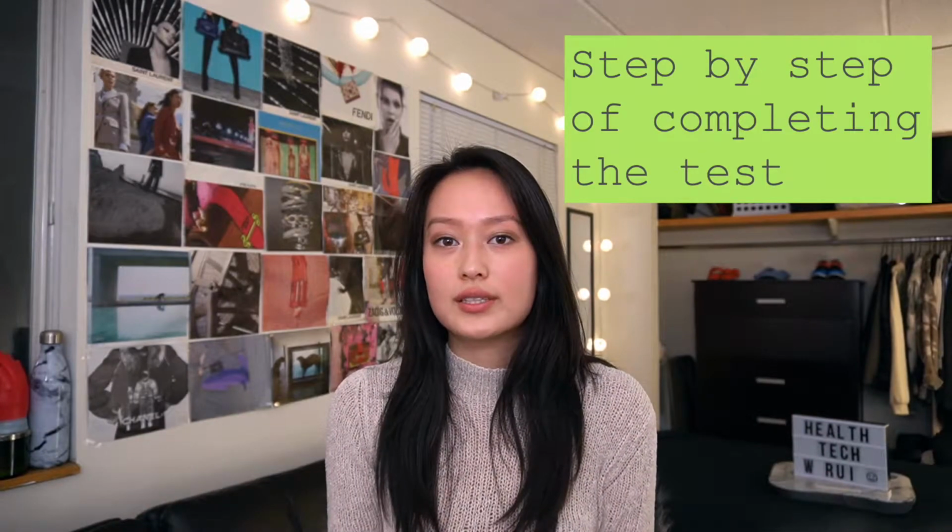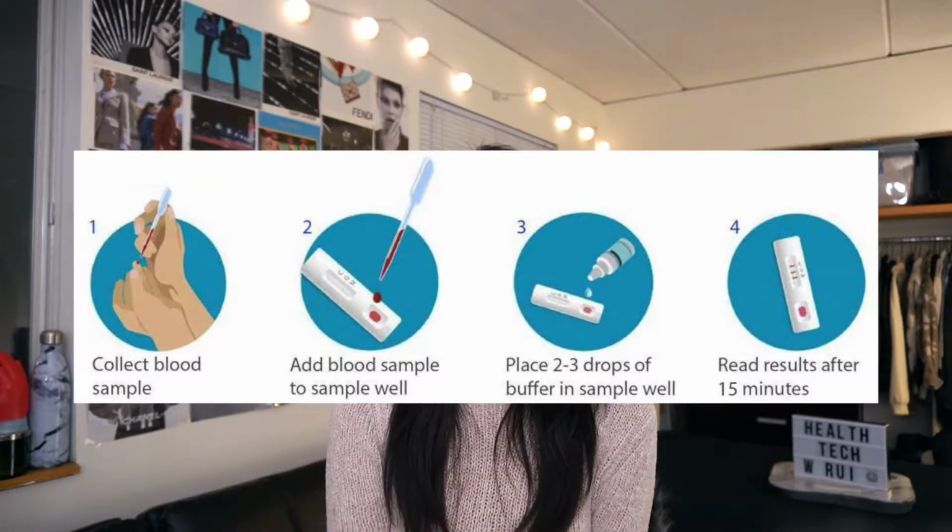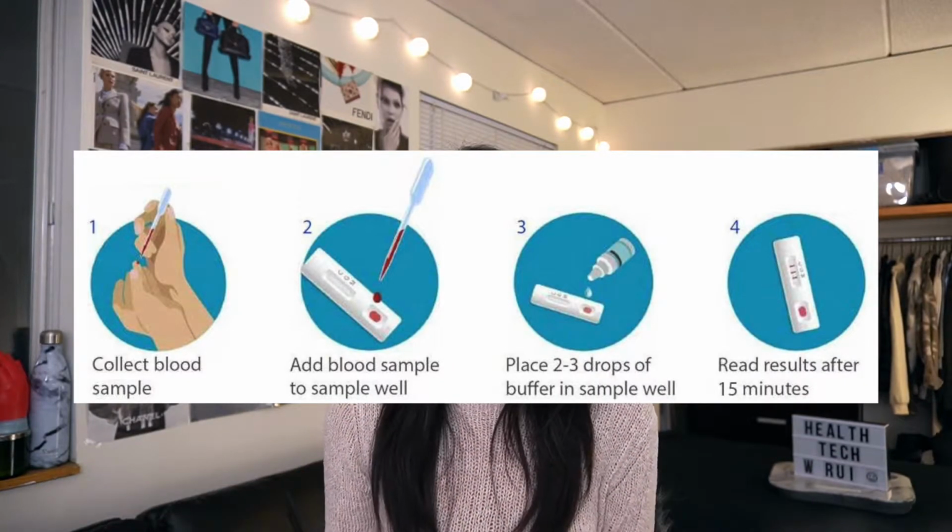So first, you take an alcohol wipe, and then you wipe the part of your finger that you want to prick, and then you prick your finger and put the small blood sample onto the rapid test. After that's done, you use your phone again, take a picture of the test with the kit, and then upload it to the server. You'll then dispose of the kit and wait for one of the Lemonaid doctors or nurse practitioners to get back to you for a further consultation.